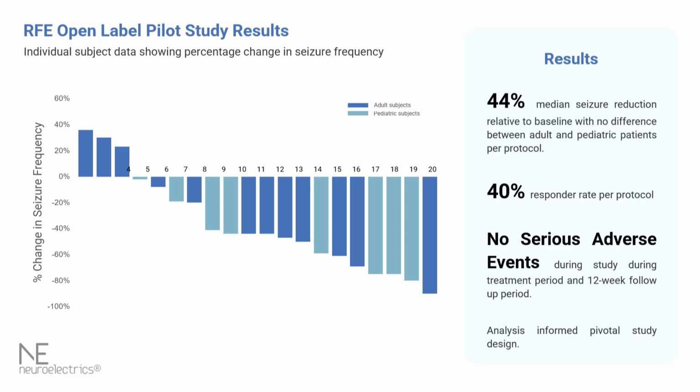So with this approach, we managed to reduce seizures almost by 50%. So remember, children and adults, they have seizures every day. They take drugs. They don't respond. The only solution is surgery. And non-invasive, 10 days, 20 minutes every day, we managed to reduce 44%. So this is the beautiful thing of being an entrepreneur. You design a technology, you bring AI, you bring science, and at the end, you're helping patients today.